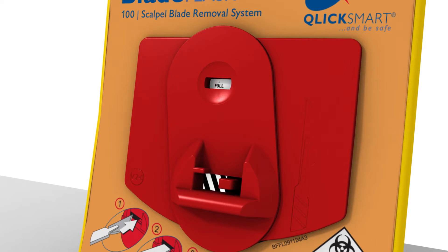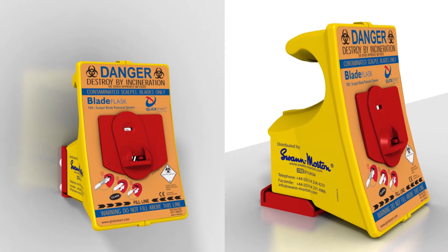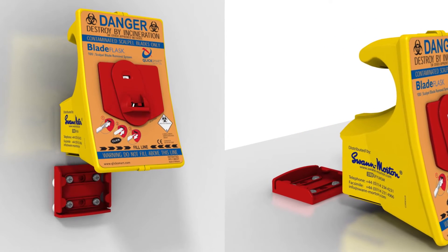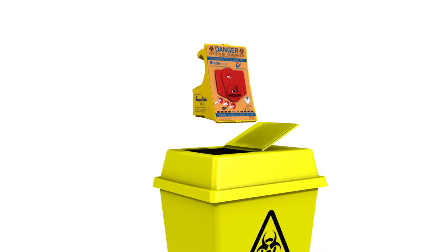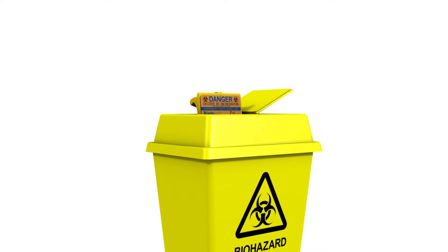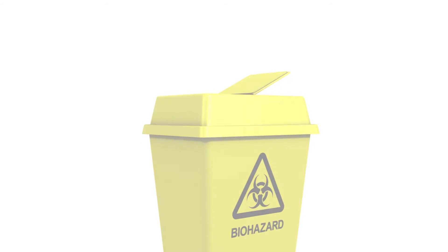When the blade flask is full, remove it from the bracket and insert a new one to continue the safe removal of scalpel blades. Always dispose of the used blade flask as a sharps container in accordance with your facility's disposal procedure.